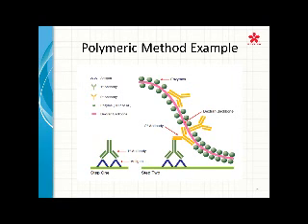Okay, so looking at the diagram, you can see that there's a unique chemistry here that permits binding of a large number of enzyme molecules, the horseradish peroxidase and the alkaline phosphatase, to a secondary antibody via the dextran backbone. And you can see the dextran backbone there. So how this works is you have your antigen, and then your antibody is applied, and then your secondary antibody and your enzyme are combined. So that's one reagent. And then they react and your chromogen is applied. I'm going to go over this a little more in detail because this is what most people are using in their laboratory.